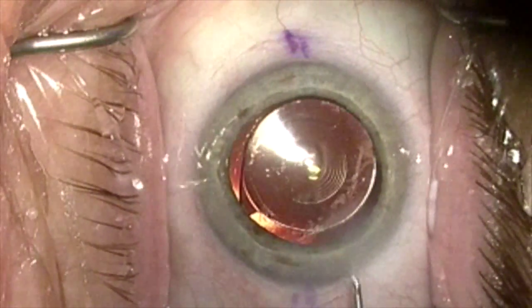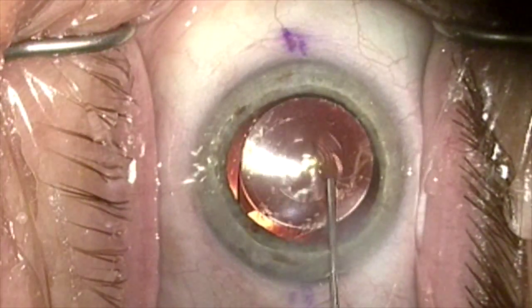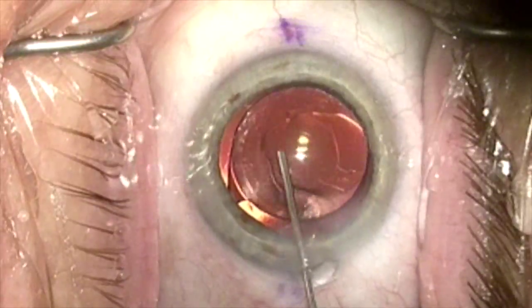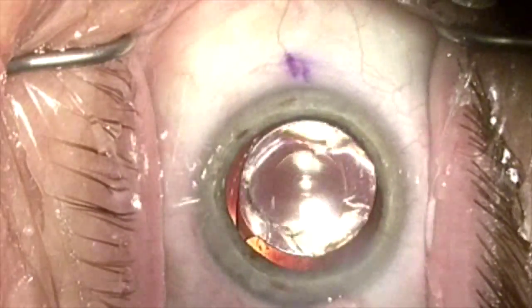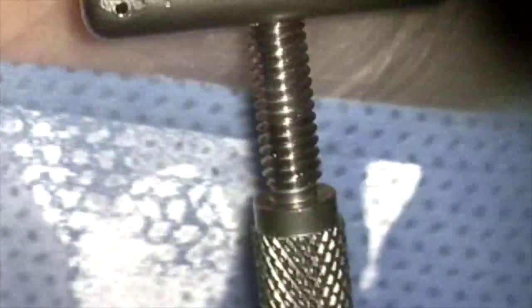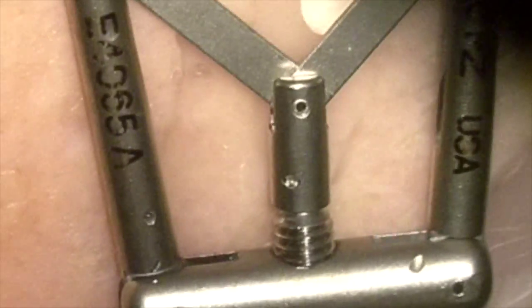Here I'm going to put in a glaucose eye stent after placing a restore implant. I'm going to pressurize the eye with dispersive viscoelastic to slightly above physiologic pressure, about 25 millimeters mercury.